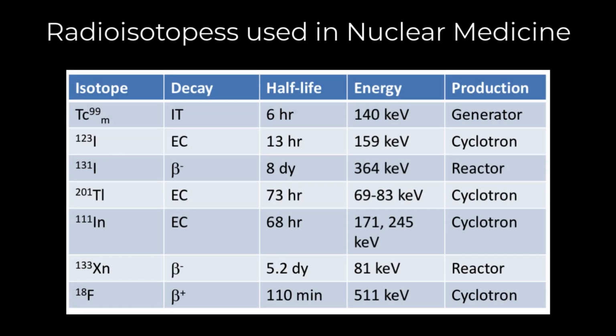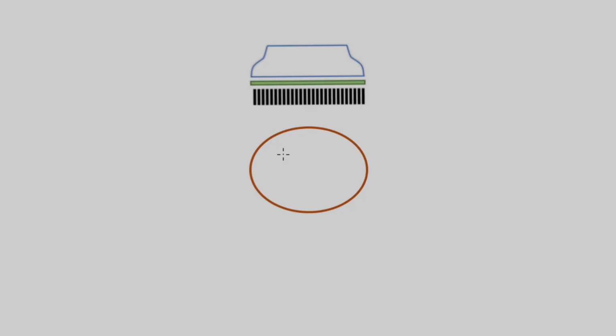So before I talk about PET, let me talk first about SPECT. That's single photon emission computed tomography. And that works on these radioisotopes that emit photons, and you can image the photons. So the geometry is this. You have the patient with the isotope that has accumulated in the tumor here. That isotope decays and emits photons, and it goes up into the system.